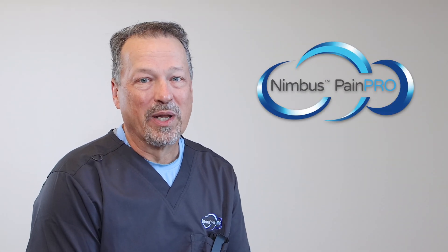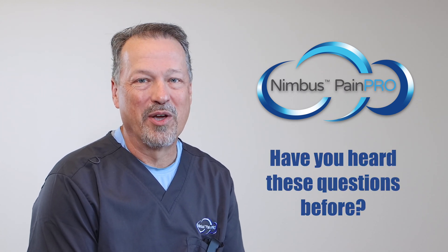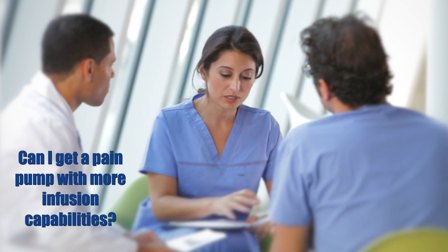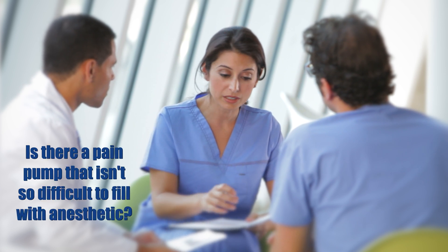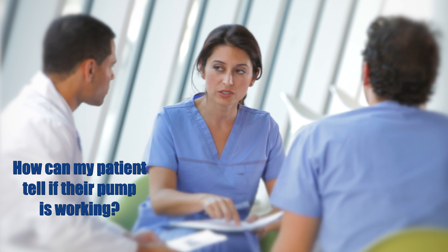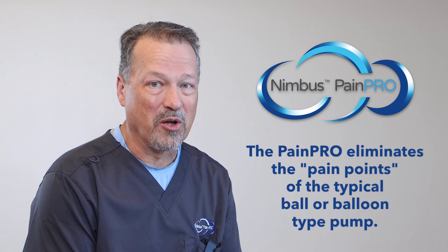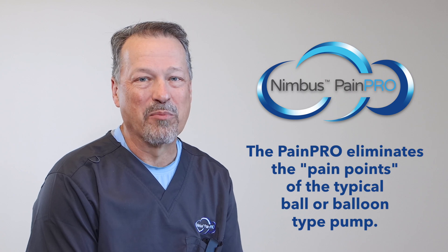If you use a typical elastomeric post-op pain pump, these questions may likely sound familiar. Can I get a pain pump with more infusion capabilities to meet new clinical needs — one that doesn't cost a fortune? Is there a pain pump that isn't so difficult to fill with anesthetic? And how can my patient tell if their pump is working? These are just some of the common pain points associated with the balloon or ball-type pain pumps — pain points that are eliminated with the Nimbus PainPro.